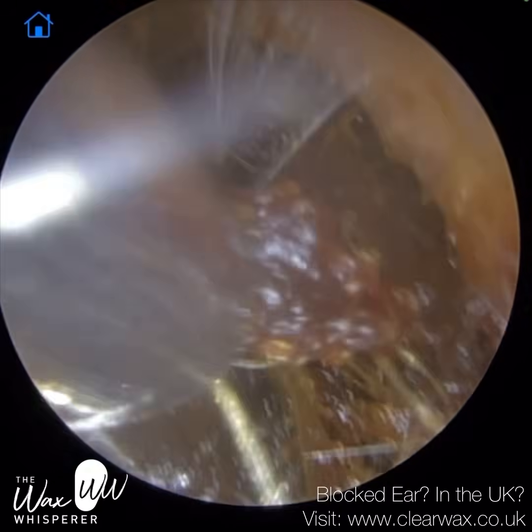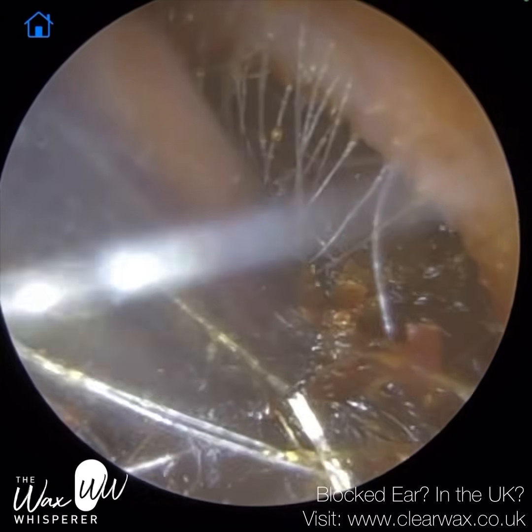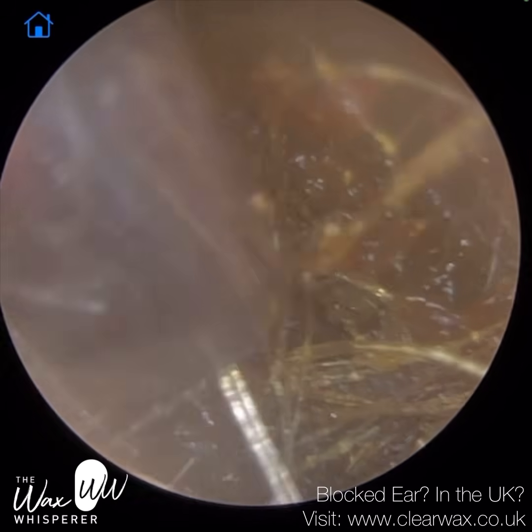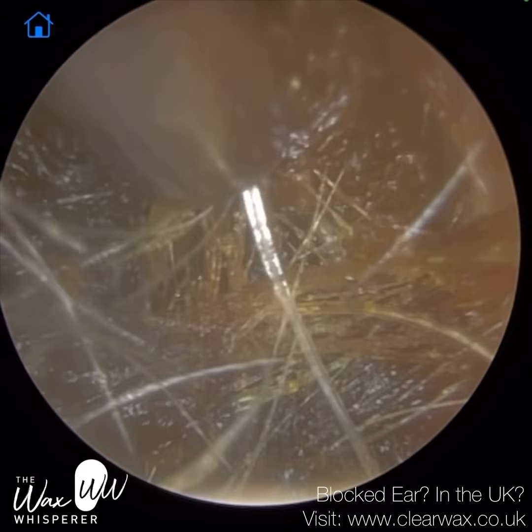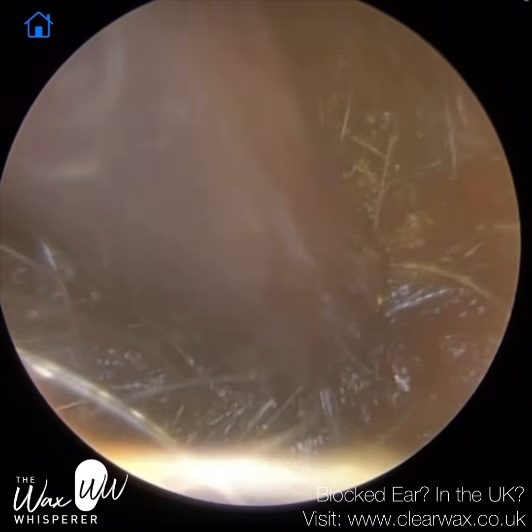And these hairs were previously protruding from the outer part of the ear canal, the cartilaginous portion. You can see some of them still around the edge. And these hairs should only be found in the outer third of the ear canal. If they're found any deeper, we've got to ask ourselves why that is.